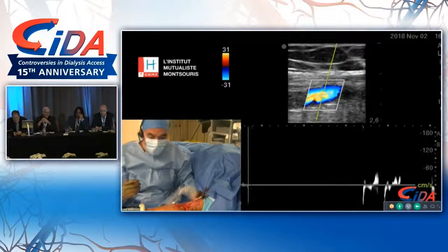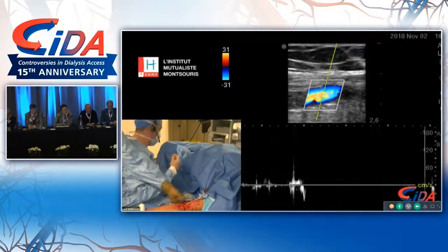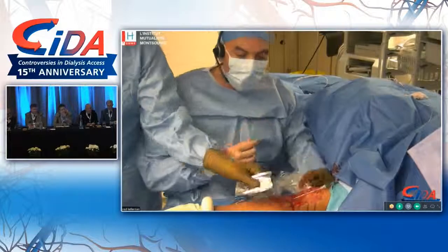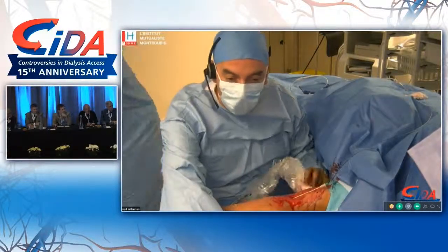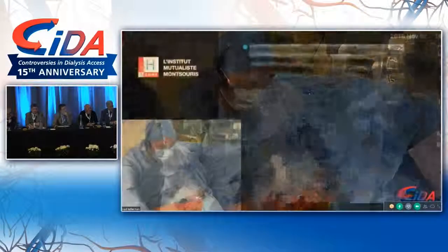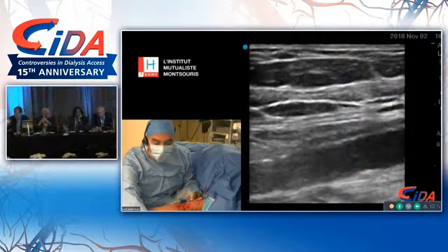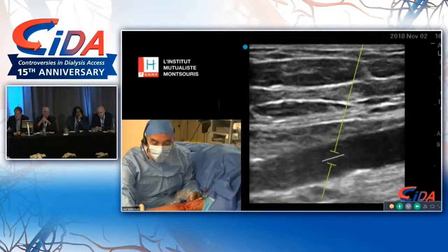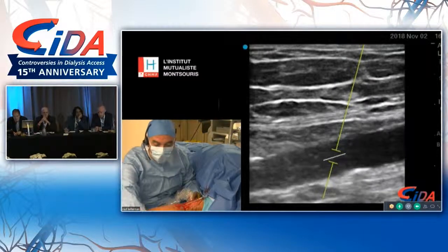So, Alex, we have about a minute or two left before we switch on to other things. Perfect. So I'm just going to measure the flow for you while you ask me a question. Any questions from the panel? Hi, Rob Jones from Birmingham, UK. Hi, Rob. How are you? Well done. Great case. Thank you, sir. Is the patient under sedation and IV analgesia, or are they completely awake with local anesthetic?